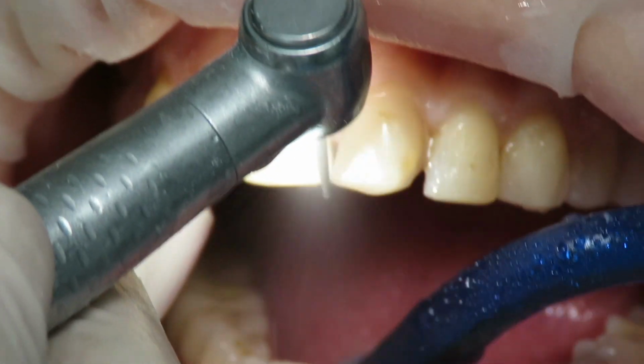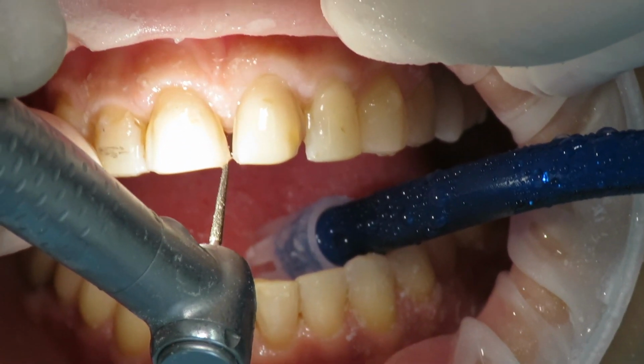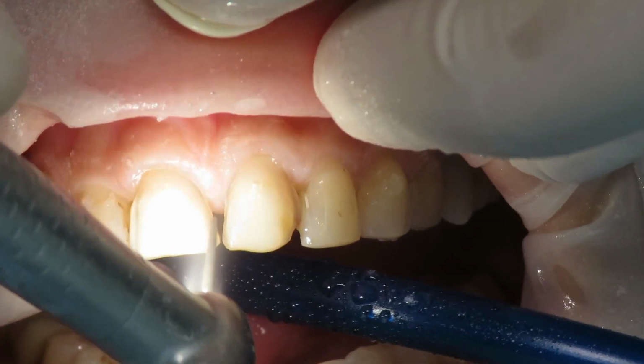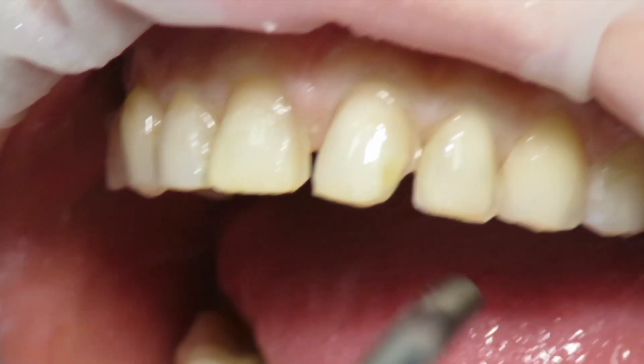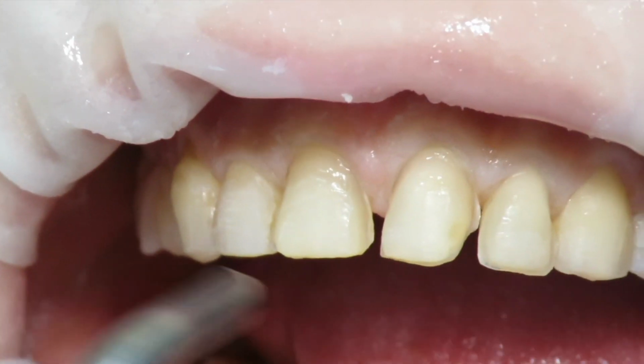The big advantage in going into a guided preparation using your mock-up is, again, to be very conservative, while having some picture of the final result according to the wax-up that was done.